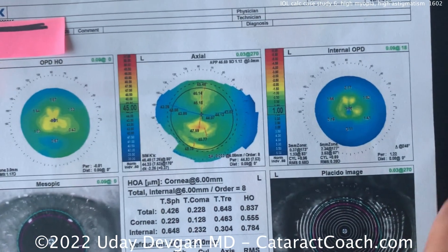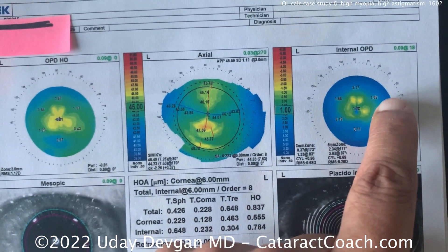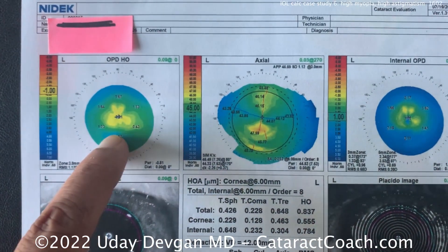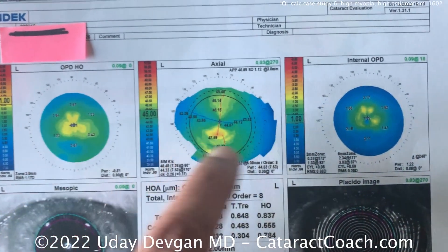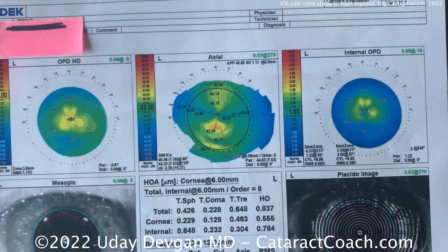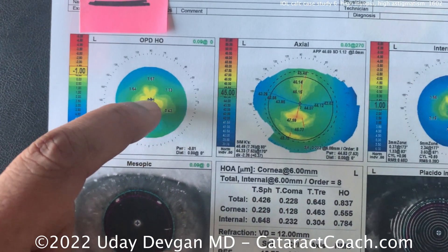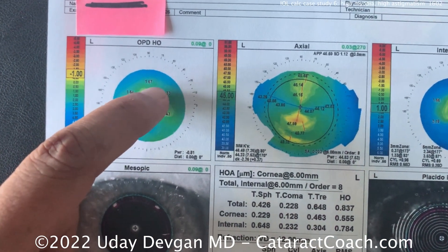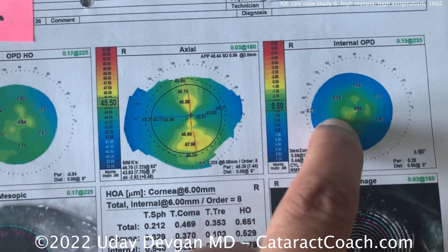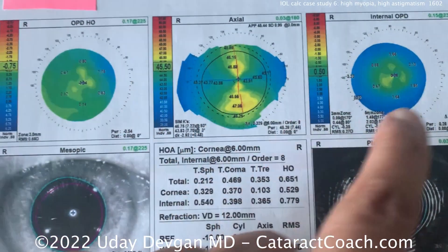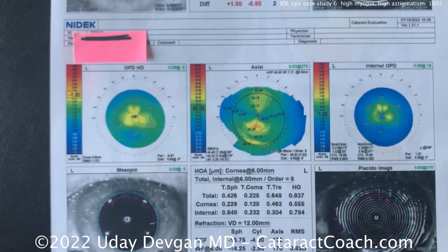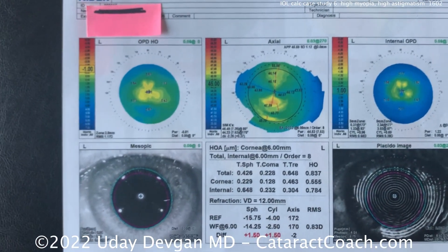Let me show you. This is the inside of the eye — that's the lens, and there's the cornea. Look what's happening: the center of the lens has a higher power. Therefore, the refraction is higher in the middle than it is in the periphery. Same in the other eye — higher power in the center of the lens. Lens plus cornea together shows that's a nuclear sclerotic cataract causing a myopic shift.